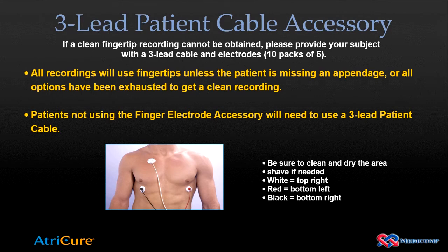So once all of the electrodes are firmly and correctly placed, they will connect the other end of the cable to the monitor, wait for the device to start up and display ready, and then they can start the recording. Recordings taken via the patient cable are 1 minute and 15 seconds, while the fingertip recordings are 60 seconds in duration.